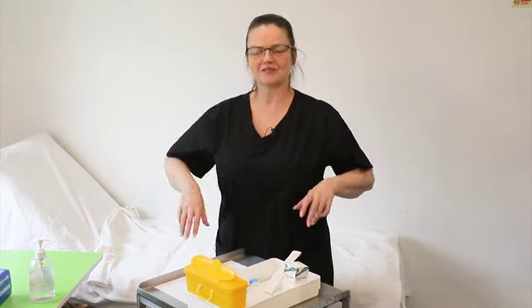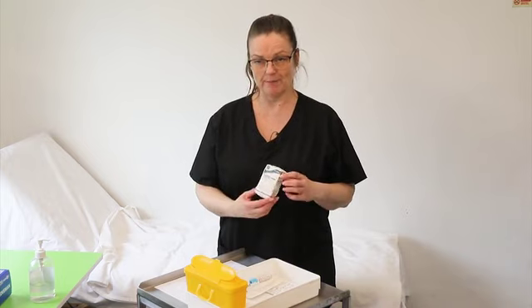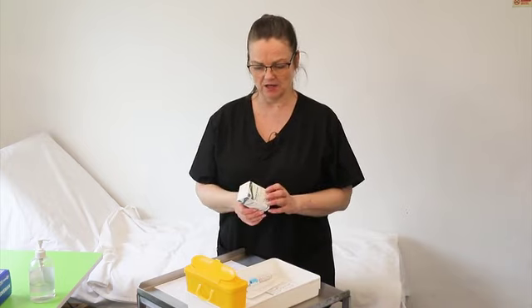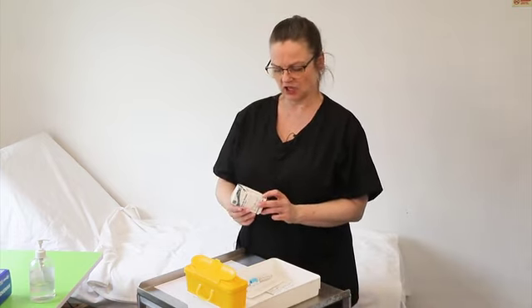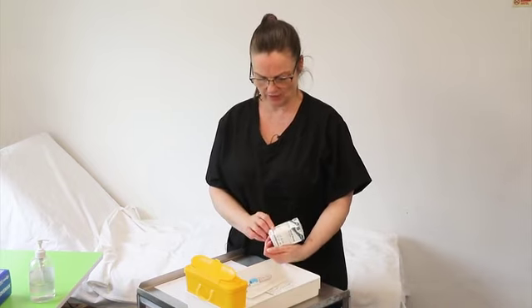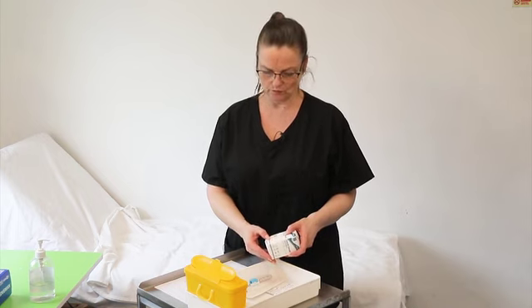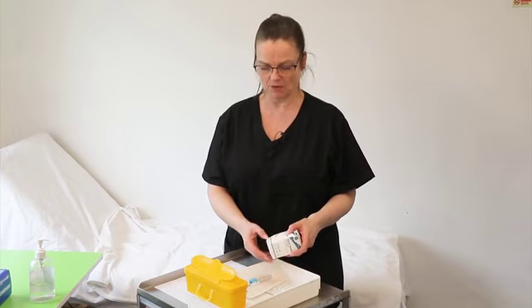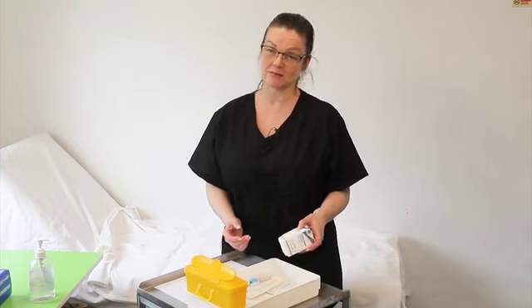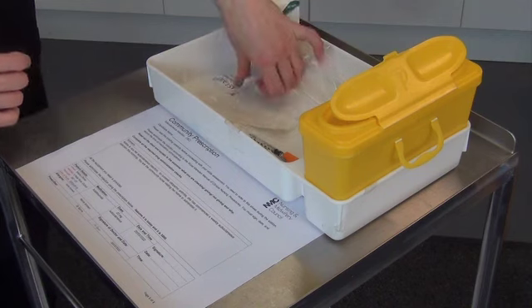So, as I said, those checks are very important. Checking the drugs is very important. We teach you to check all the equipment and all the stuff that you're using. So this is gauze swabs, and we would like to see you checking for the expiry date, which is there, and it's actually like a little egg timer symbol. So that is the expiry date. There's also a factory date, which is when it was manufactured. Some people look at that date and always tell me I've got expired equipment, but that's actually when it was manufactured. So please do know the differences.